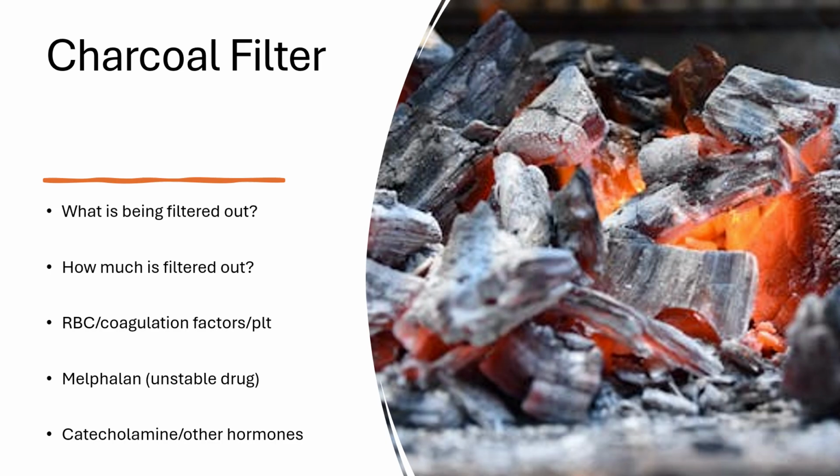So the charcoal filter is probably one of the main reasons why the patient gets very hypotensive. And the question is, what is being filtered out and how much is being filtered out? RBCs, coagulation factors, platelets, melphalan, of course, and how much, and whether it also filters out catecholamine and any other hormones. And charcoal is a non-specific filter system, so it can filter out almost anything that's circulating through the blood.